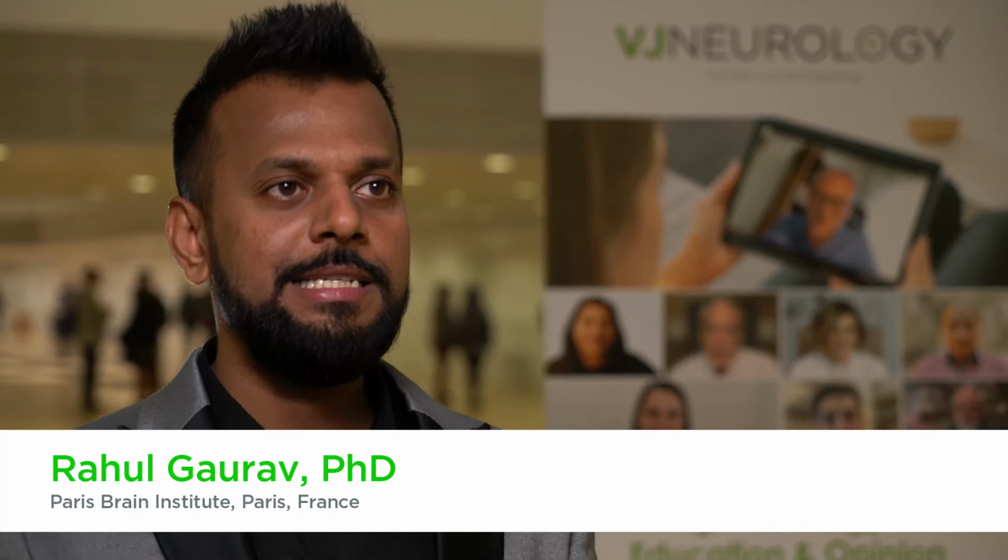What is very interesting about these recent artificial intelligence technologies, particularly deep learning technology, is that it has been quite famous in other computer vision tasks, in microscopic data, etc. So what we are doing here is getting inspired by these results from microscopes, imaging, or other sort of imaging like computer vision tasks, and we are trying to use this idea to see whether we can segment these difficult regions, difficult to visualize even by medical doctors, by making the model learn using these ground truths.